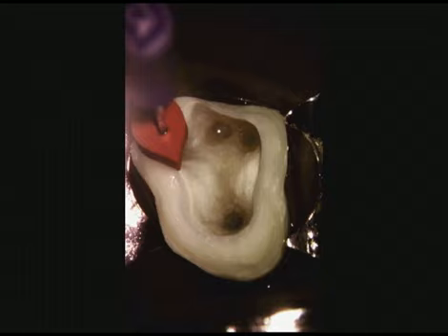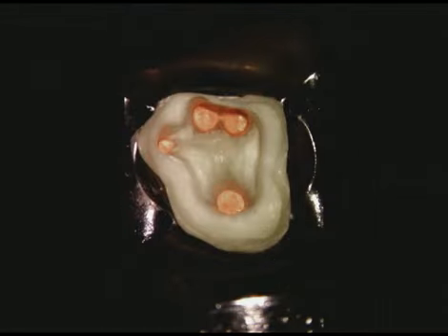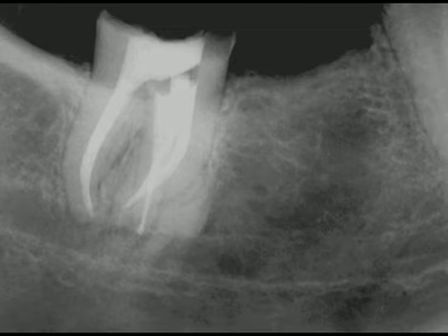This paves the way for the Pro Ultra Endo 1 using the 10-minute rule. Following post removal, cement is removed from the mesiolingual aspect of the pulpal floor and a displaced extra orifice is identified and the canal negotiated. We can observe the pulpal floor following 3-dimensional cleaning, shaping, and obturation procedures. A post-operative radiograph confirms the disassembly efforts, the smooth flowing shapes, and the packed systems.